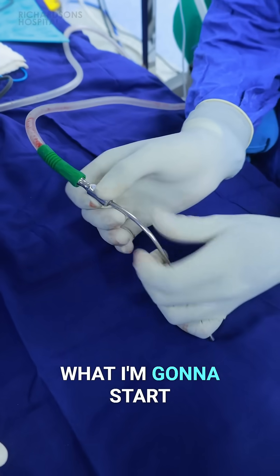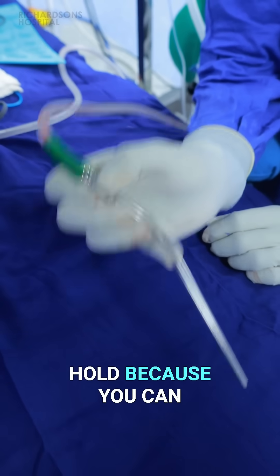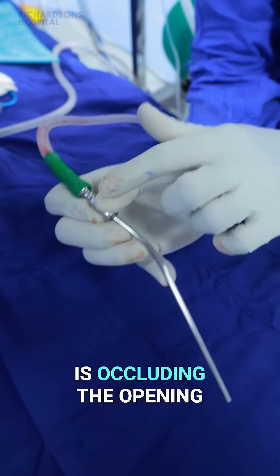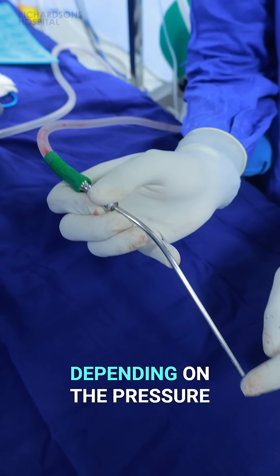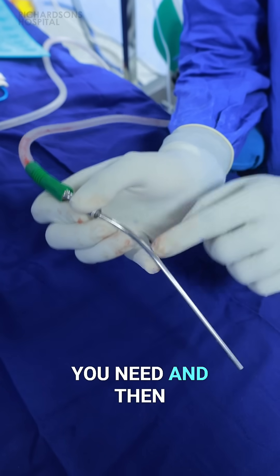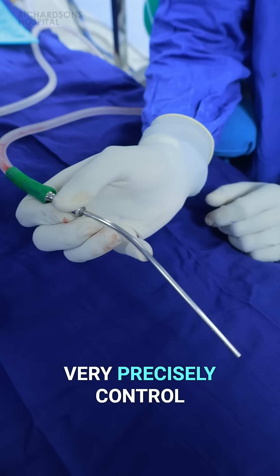The best way is what I'm going to start off with. This is the way I like to hold it — you can see your thumb is occluding the opening, which you can close depending on the pressure you need, and then all the fingers are there so you can very precisely control it.